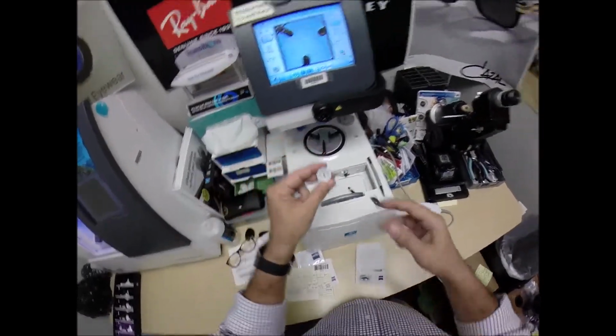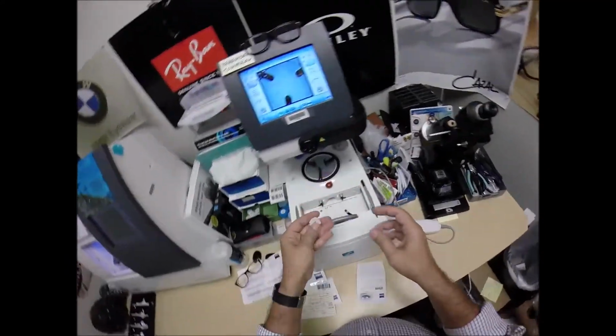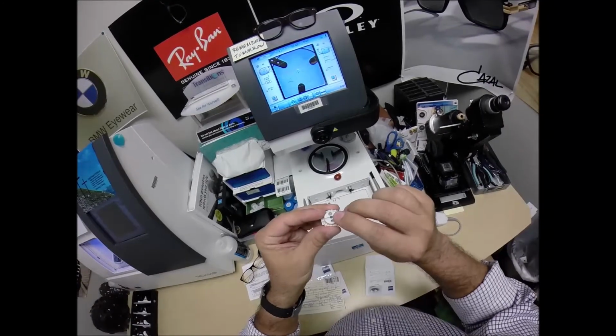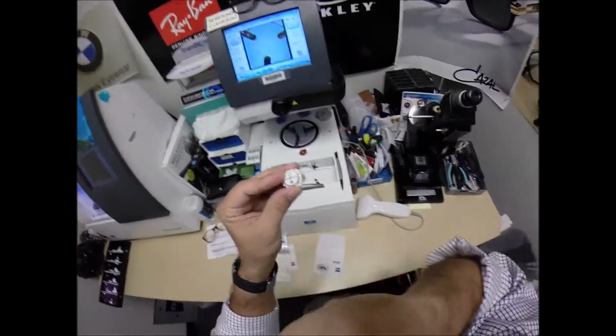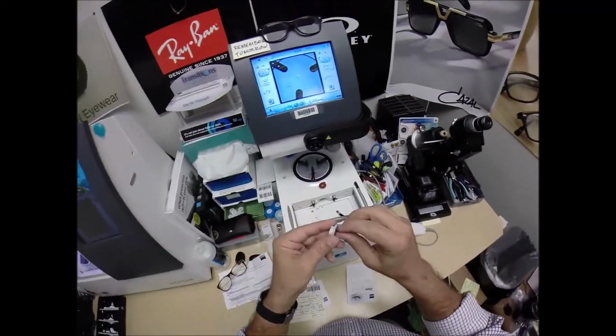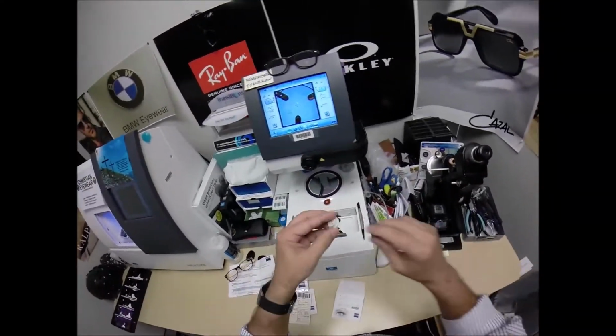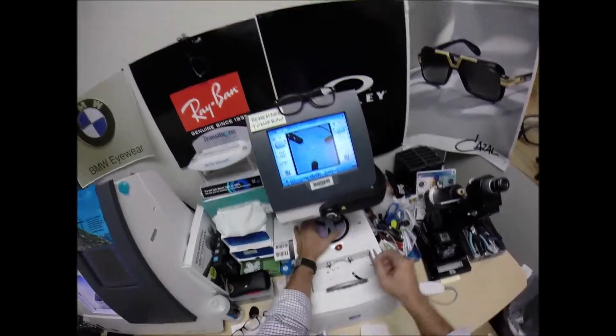It was your time. Okay, so stick that sticker on the first block. Do the same thing now for the second one. That sticker on the silver button on the back is a magnet. It's going to do its job twice. The first time it's going to attach itself to another magnet there in the arm. Pull the sticker away. Make the black side sticky.